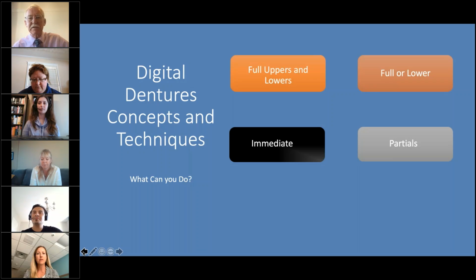Although it seems flexible, in the partials you've got to make it a wee bit thicker than what you normally would with a chrome, but a lot thinner than you would with a plastic, to try and get a wee bit of rigidity. But as Deborah said, for implant cases, for a secondary casting for strength, it's really, really good.